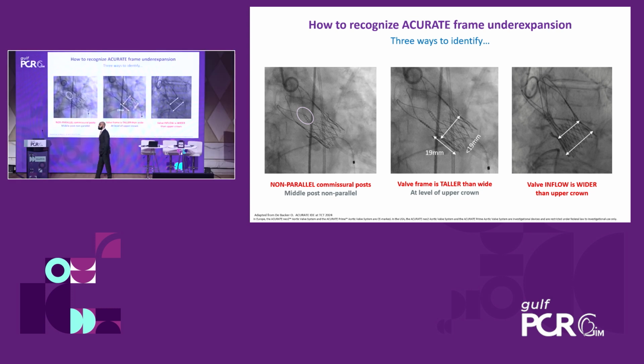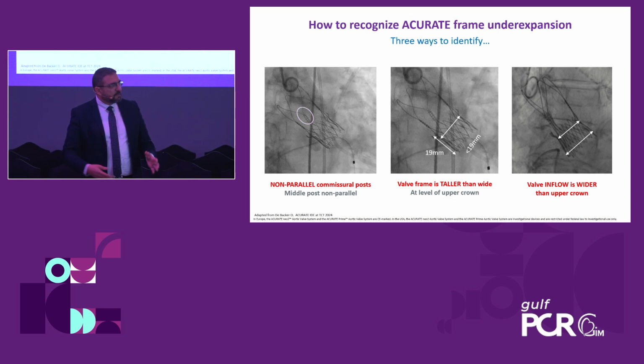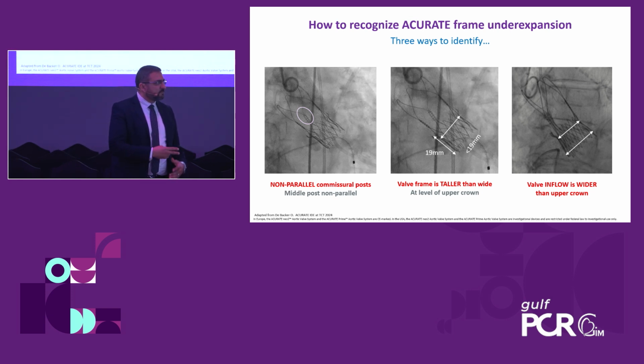Well, the good thing with post-dilatation is that you don't even need an extra cost, because you usually post-dilate with the same balloon you pre-dilate with. Correct, yes. The balloon is there, the wire is there. You just go and do an extra step. It takes a couple of minutes, and then you're done.